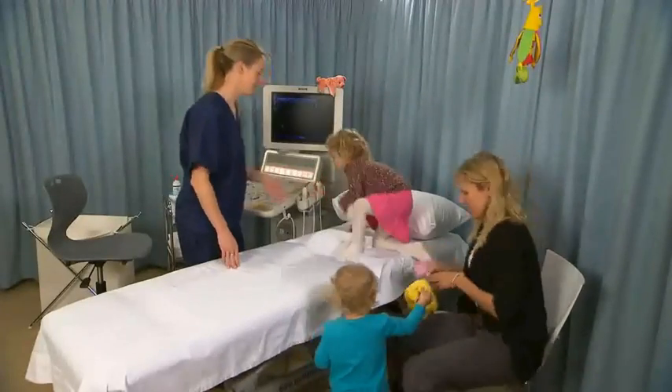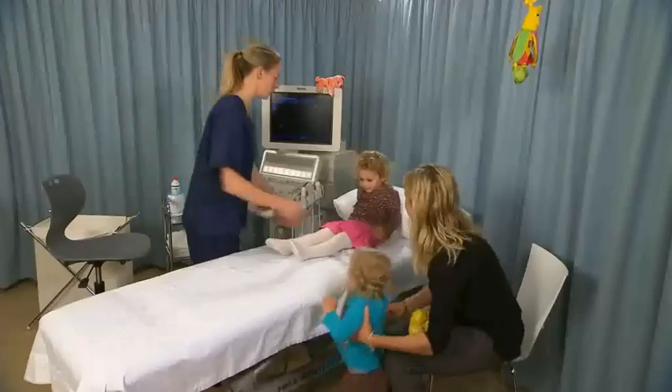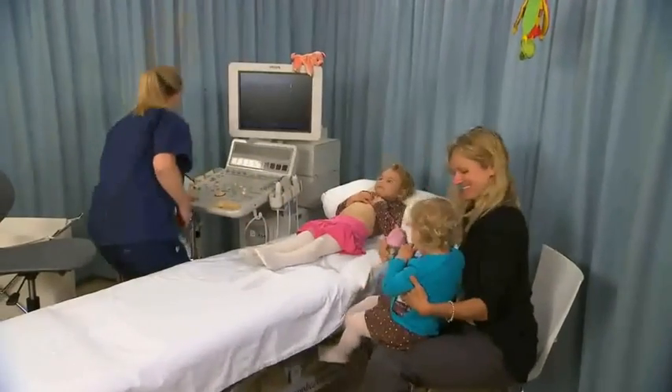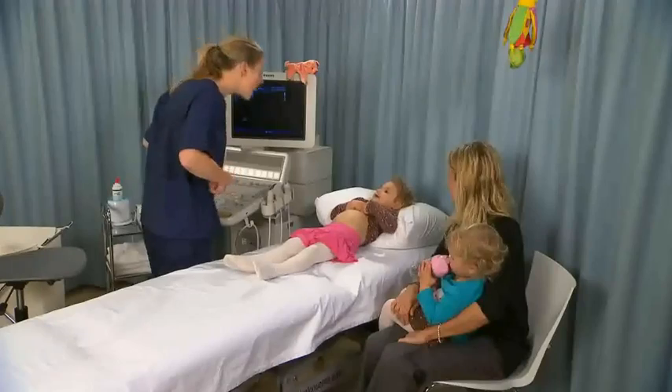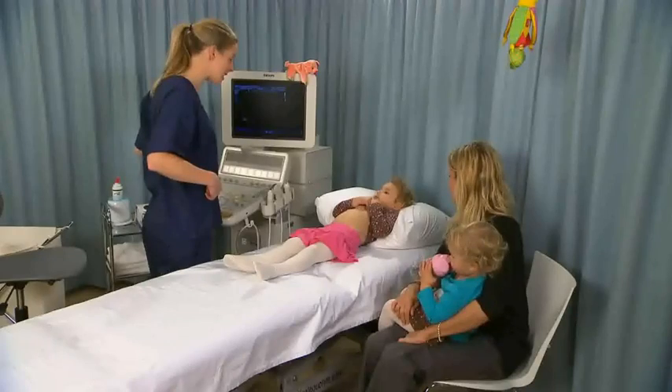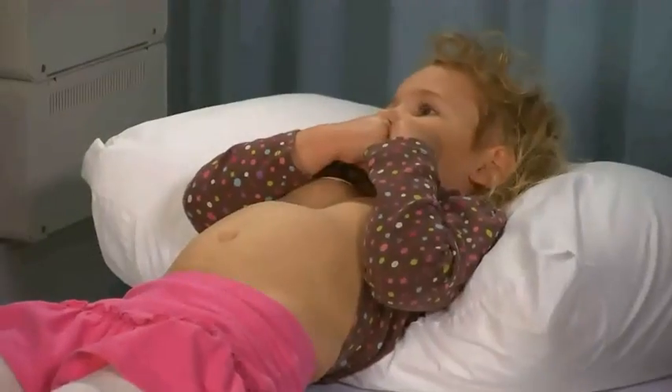Ask the child to climb onto, or ask the guardian to lift the child onto, the examination table. The child's signs, symptoms, and medical history may often be obtained verbally from the guardian. However, when asked where they are sore or where it is painful, most children are able to point to a region.